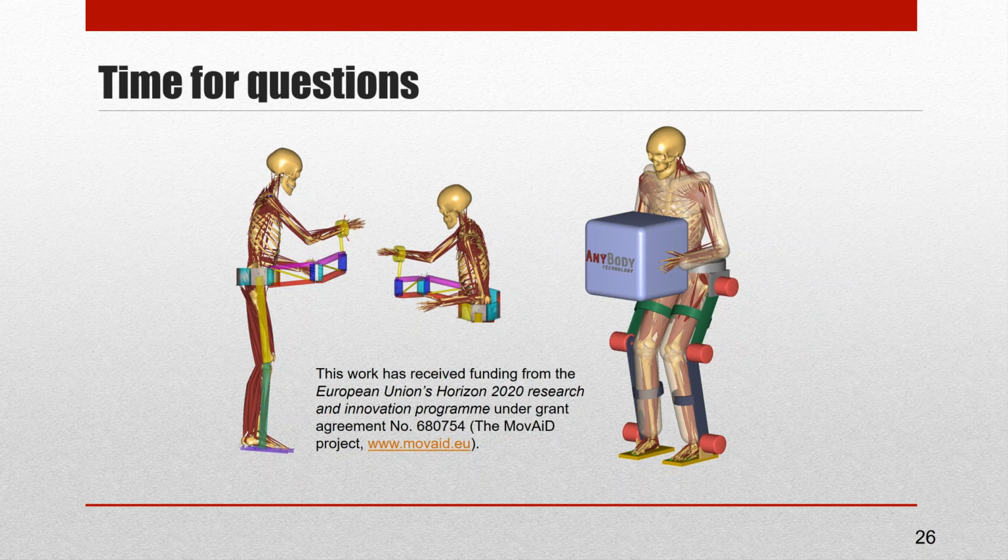Okay, thanks. So the next question is, how do we define contact force between the exoskeleton and human? Yeah, that's kind of technical. As I mentioned, the contact force is a unilateral force, and if you know about mechanical analysis, you know that unilateral forces or contact forces usually complicate analysis problems a lot, because they introduce a nonlinear component into the analysis problem. It's not exactly like that in AnyBody, because everything in AnyBody is already very nonlinear, so it doesn't really complicate things further in that respect.